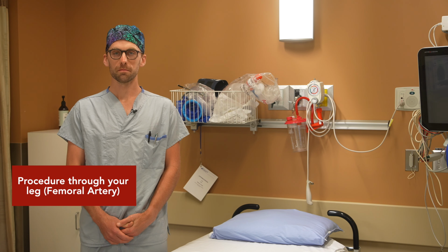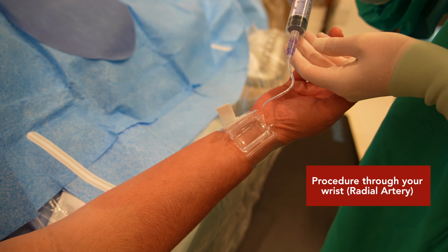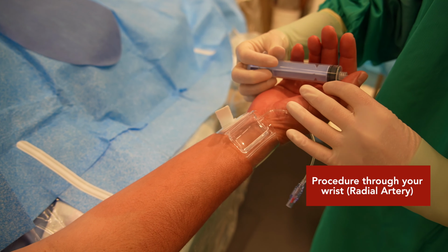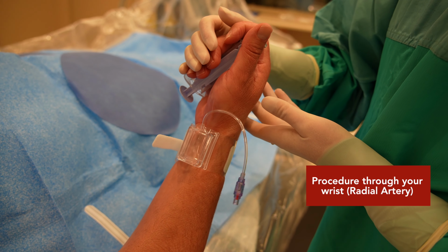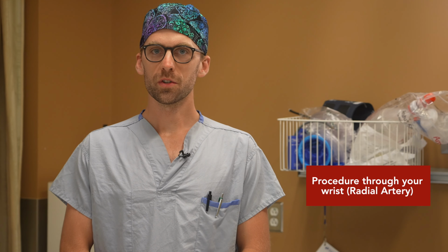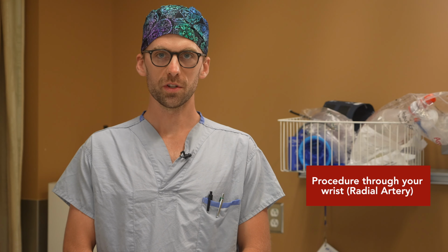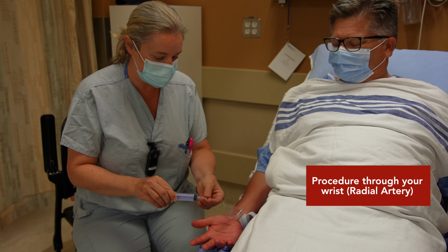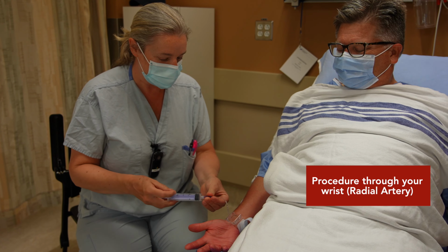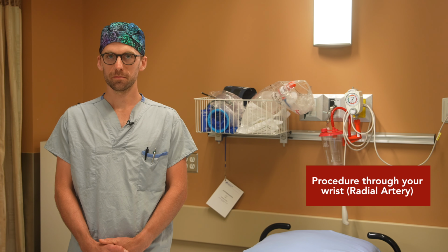If the procedure was done through the artery in your wrist, a nurse will remove the tube while placing a tight wristband that provides pressure to prevent you from bleeding. Once the wristband has been applied, you will be moved over to a stretcher and will return to the admitting area for your recovery. You will be able to sit up in bed immediately after your procedure. The nursing staff will slowly remove the air in the tight wristband over the next couple of hours. You are encouraged not to use your hand or wrist for 24 hours to allow the artery to heal and reduce the risk of scar formation in your wrist.